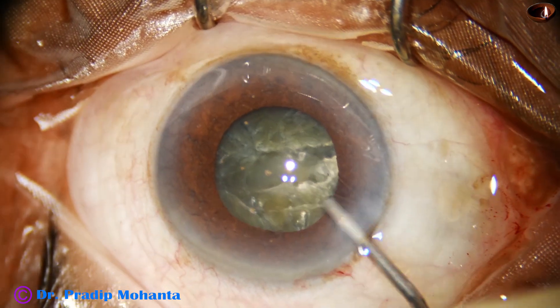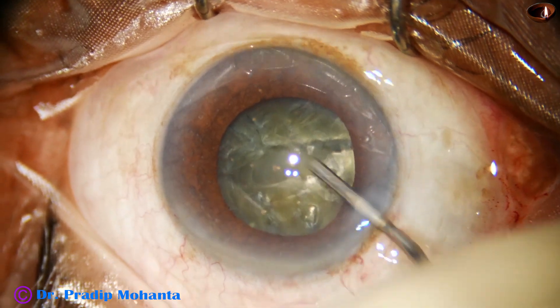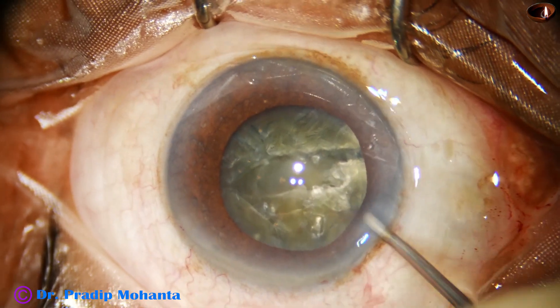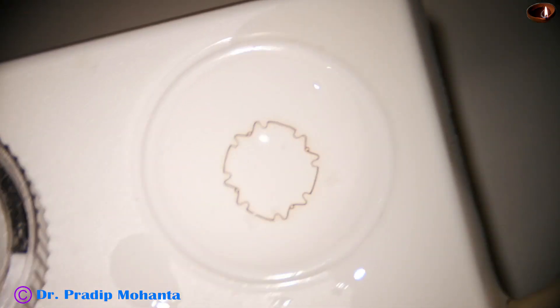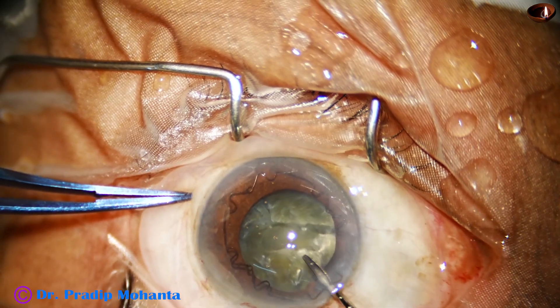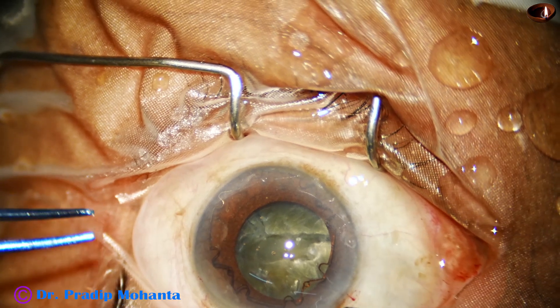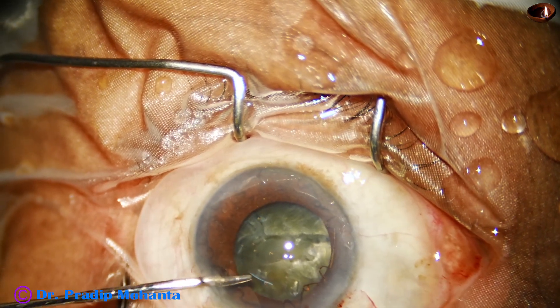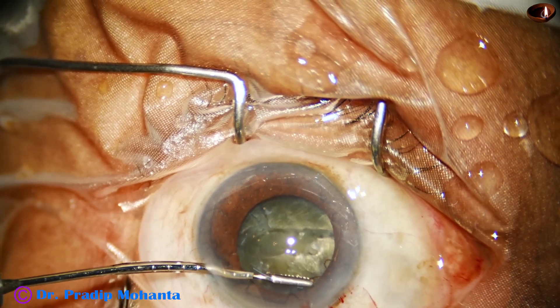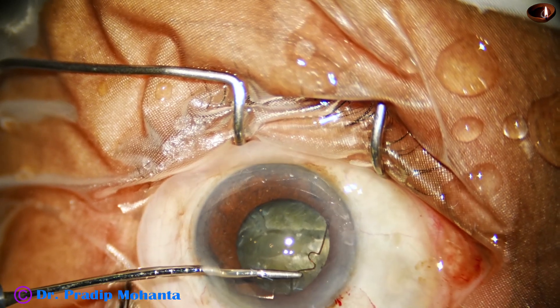So I decide immediately to use the B-Octa pupil expansion device. Because in such cases, when the pupil is already dilating to about 7 mm with the viscoelastic, B-hex may not be the ideal device to use. So B-Octa is the best choice in such cases.